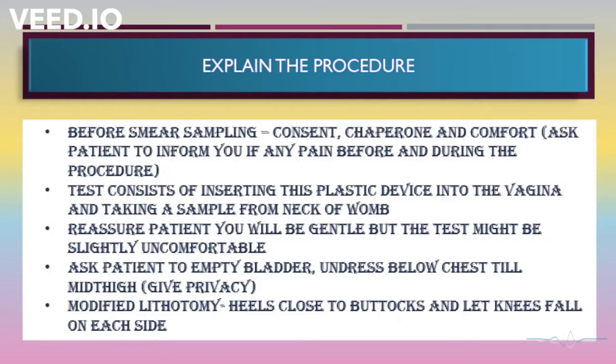So how would you explain this procedure? Before smear sampling, always take the consent of the patient. Tell the patient that you will be having a female chaperone with you, and ask the patient if she has any pain before and during the procedure. So you need to check for her comfort.